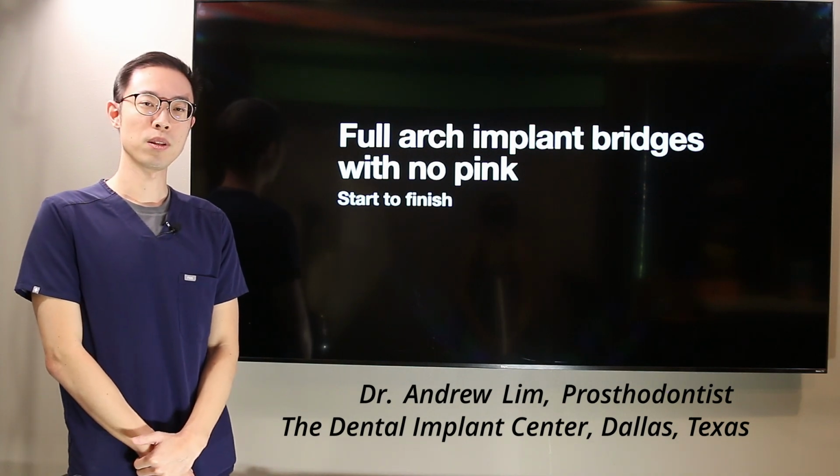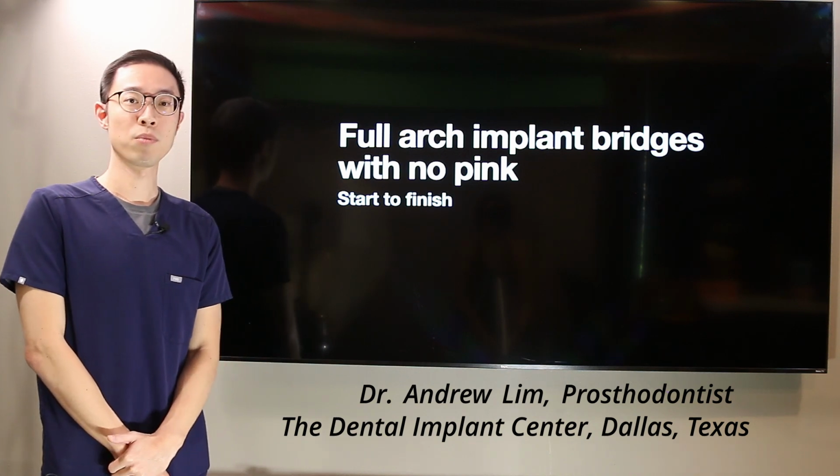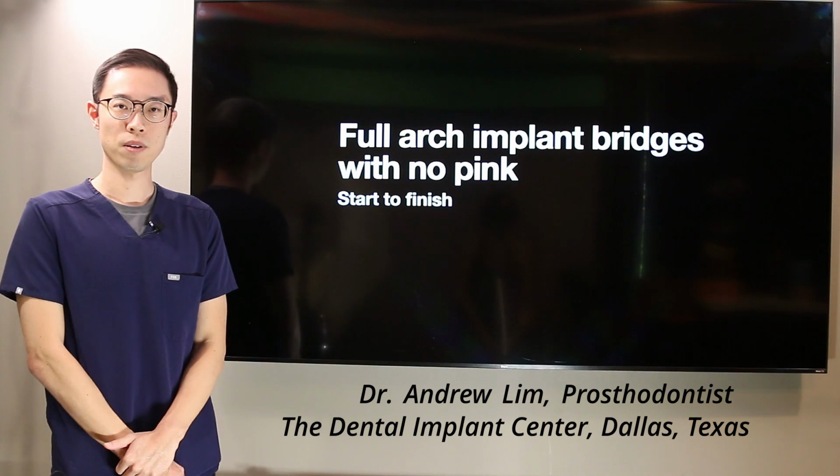Today, I want to share with you a case that we did in the Dental Implant Center. It's a full arch of implant bridges with no pink, as you can see, from start to finish.